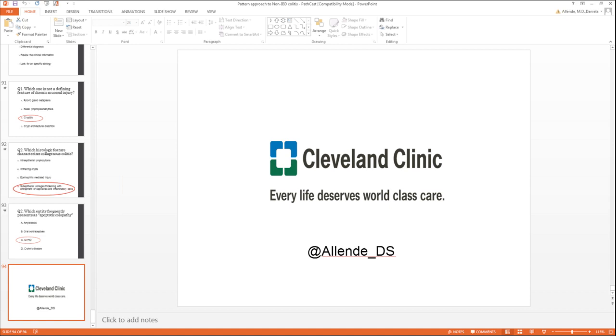I will have to say that in the setting of IBD, which is not the topic for today, but just as a quick comment, there are instances in which we leave those cases as indeterminate for dysplasia, just because there's not enough convincing evidence that it's neoplastic. So that is a possibility for IBD, but we try not to use indefinite for dysplasia in other settings because it's less meaningful. We try to make a call, but there are cases in which it's challenging.